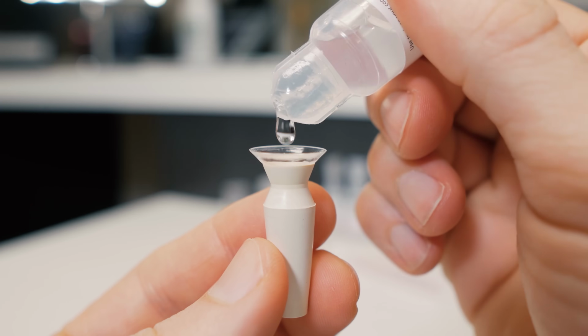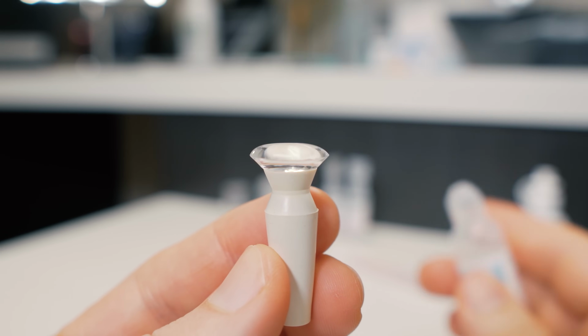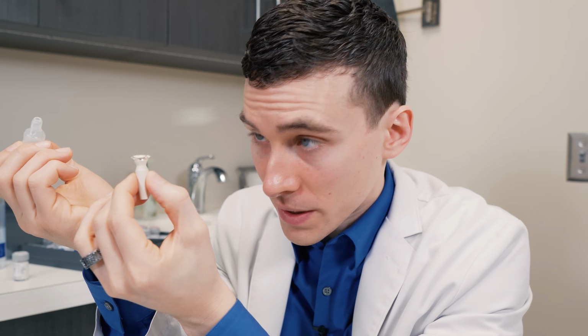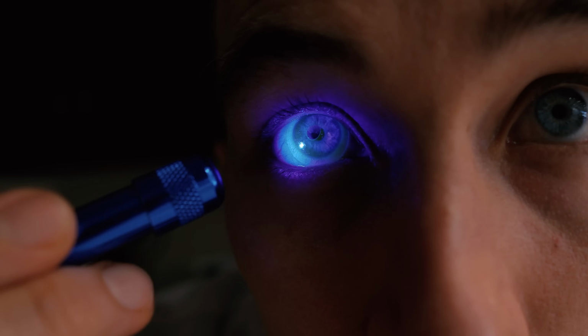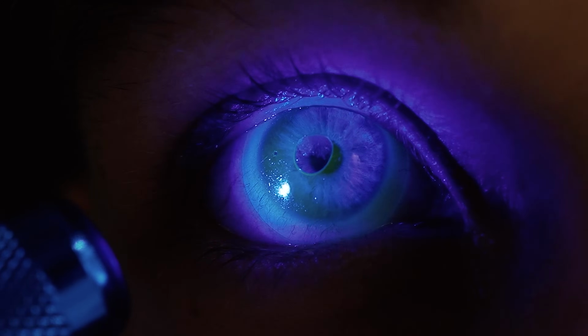Now, you'll need to fill the bowl of the lens completely all the way to the top. That way you can kind of see a bubble of fluid forming on the top. If you don't fill the bowl completely, then you're likely going to get a bubble when you apply the lens, and then you're not going to see well, and the lens is going to move and it won't be as comfortable. Now, inserting the scleral lens, you want to have your face completely parallel to the floor. Some people find using a mirror or something as a fixation target on the counter can help you with inserting the lens and getting it in the right spot.